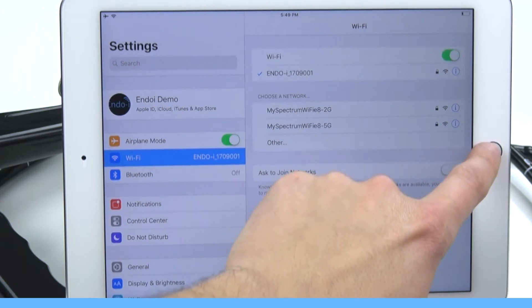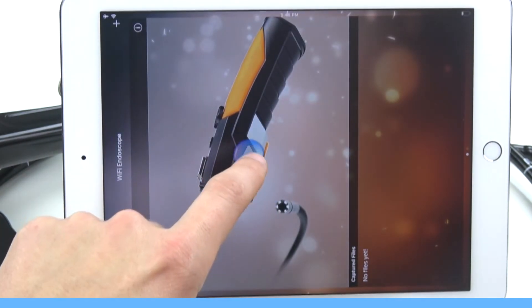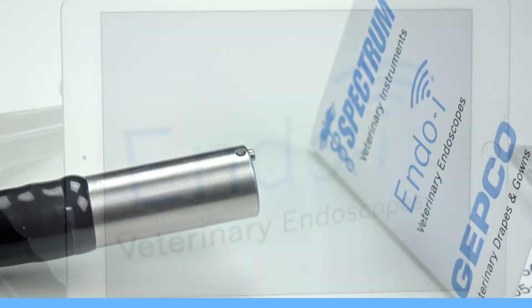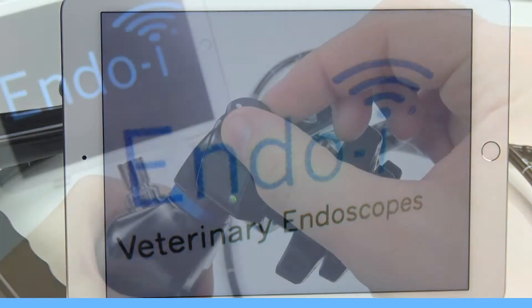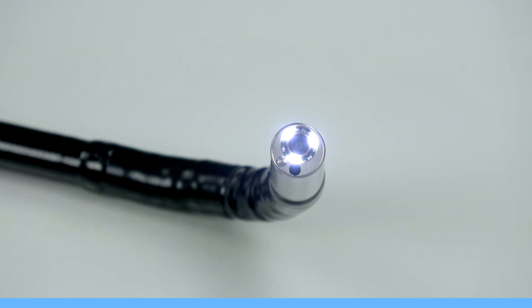Let's go back to the home page of our tablet and go to the Wi-Fi Endoscope app. Choose the app and then hit the play button to display your image. At this point, you should see the image on your tablet. Be sure to adjust your light source output to optimize your experience.